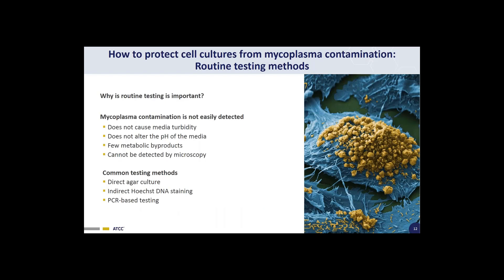Why is routine testing important? Mycoplasma contamination is not easily detected — it does not cause media turbidity, it does not alter the pH of the media, it produces few metabolic byproducts, and it cannot be easily detected by microscopy. For this reason, three common testing methods are recommended: the direct agar culture, the indirect Hoechst DNA stain, and the PCR-based test. Let's look at each one of these tests in more detail.